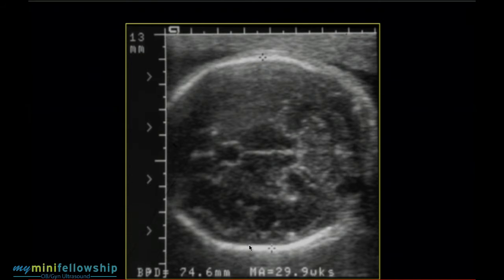Okay, how do we know we're getting the correct biparietal diameter? What you want to see to know you're getting the measurement at the right level is the 3rd ventricle flanked by the thalamic nuclei. That tells you you're at the correct level. How do you know that the beam is not inappropriately at an angle of inclination to the perpendicular?